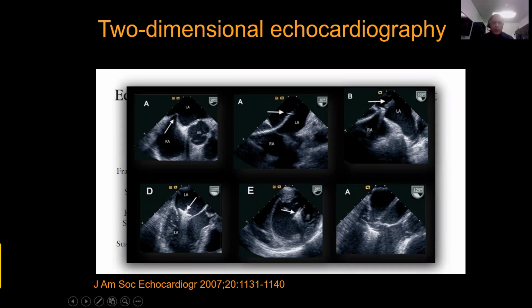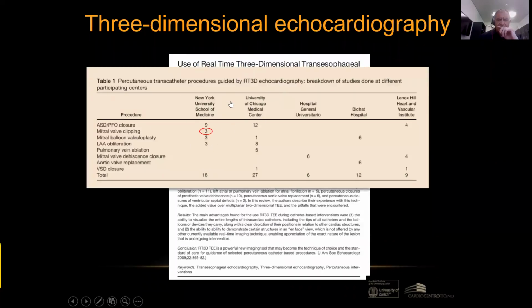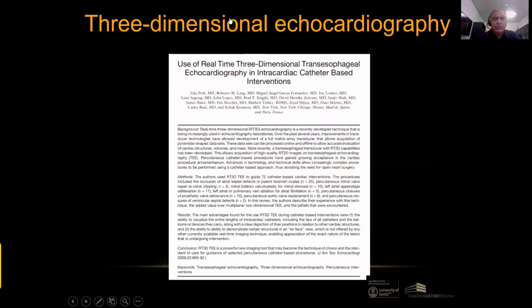Well, of course we use 2D echocardiography, but we now have other techniques. This is a paper from Gila Perk and Isaac Kronzon, but other people participated, at five hospitals at that time, more than 10 years ago: New York University, Chicago, Madrid, Paris Bichat Hospital, and the Lenox Hill Hospital. You see the use of real-time three-dimensional transesophageal echocardiography in the interventional procedure, not only 2D echocardiography anymore, but also 3D.